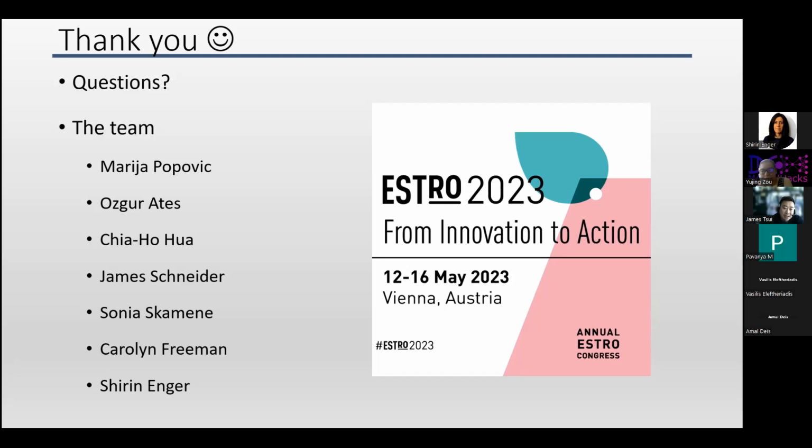Limbus AI or others like RayStation, RaySearch, Varian, and Elekta, they all have their own flavor of auto segmentation. They all use similar techniques or maybe some new ones. I would say use their product first, and only develop something when it doesn't meet your need. And again, a very stringent quality process is required.